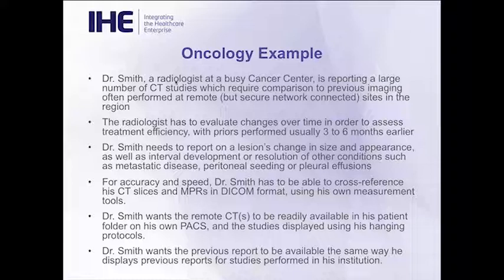You cannot do cross-referencing, you cannot compare your MPRs, and you cannot adjust the measurement the same way, which can be critical when you're looking for small metastatic disease or peritoneal seeding, which change over time. So that may have an impact.